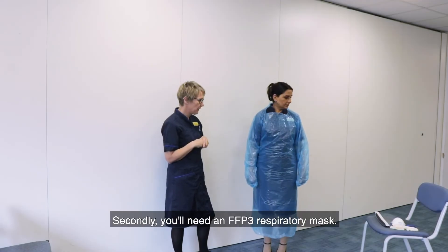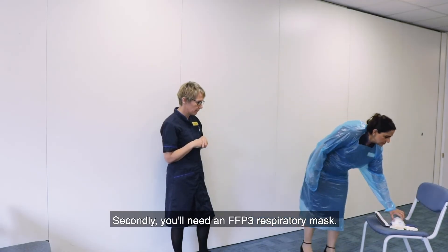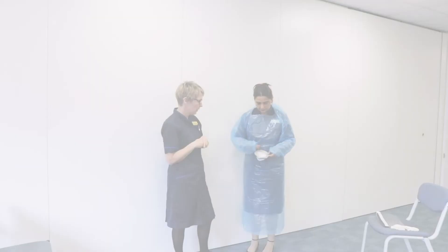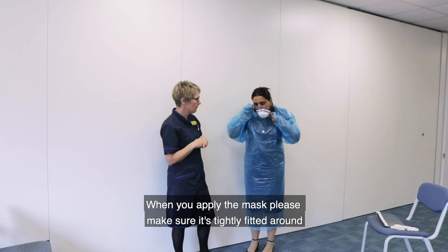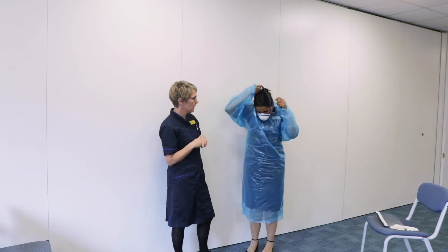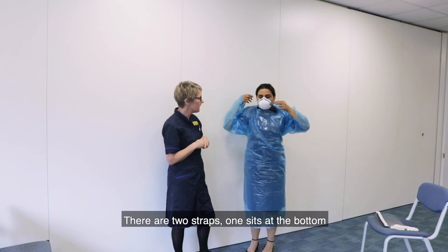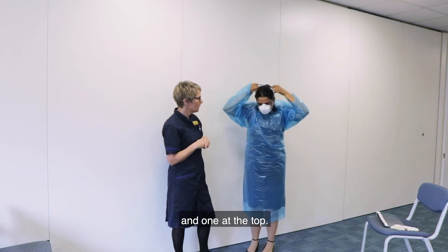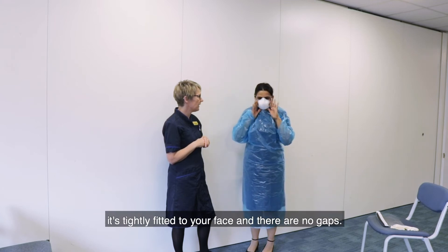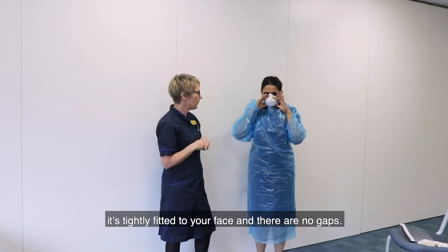Secondly, you'll need an FFP3 respiratory mask. These masks you need to be fit tested for. When you apply the mask, please make sure it's tightly fitted around your mouth and nose. There are two straps — one sits at the bottom and one at the top. When you have it on, please check it's tightly fitted to your face and there are no gaps.